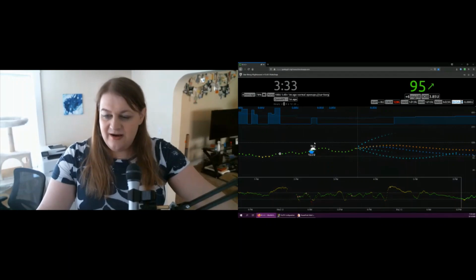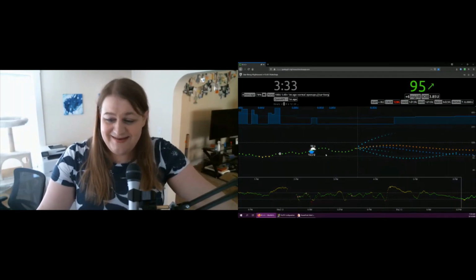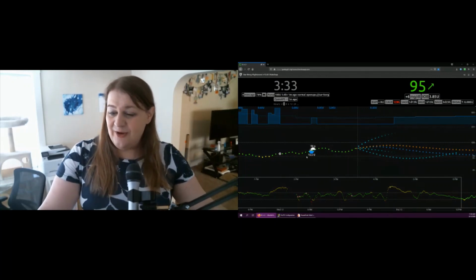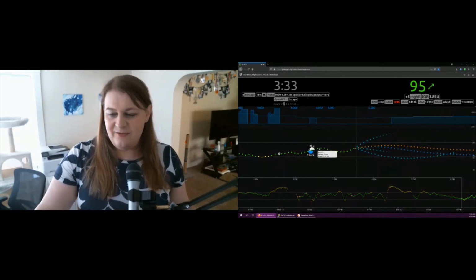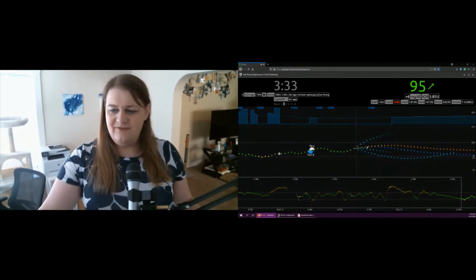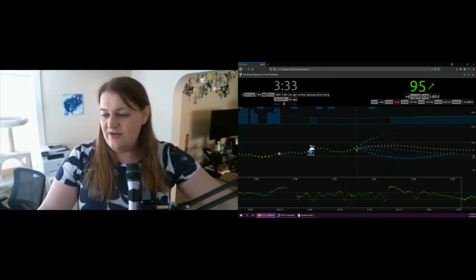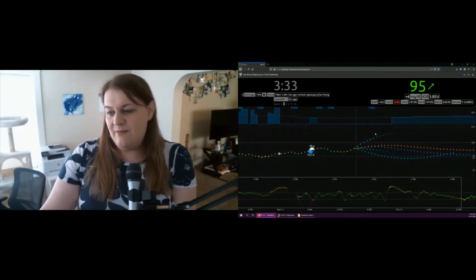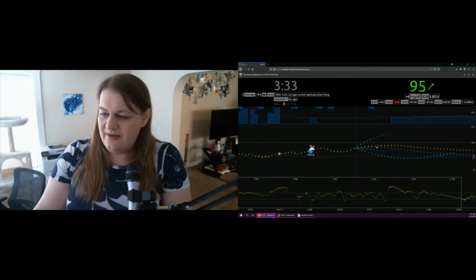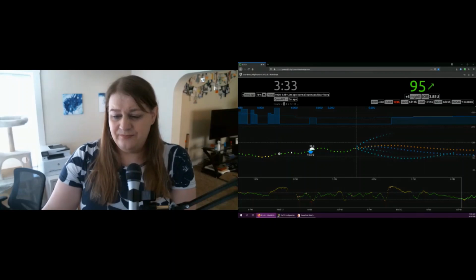So I can also look here for breakfast. I had 56 carbs of breakfast sandwiches. I took 10 units for it. So you can kind of see they're fairly close together. It rose a little bit, then the insulin kicked in, so it kind of fell back again. And these are the trends it's predicting. So the orange is kind of where it's expecting it to go. The other ones are some other variables. You can kind of see combined together, it produces the orange. So it's looking like I'm going to stay pretty in range given its calculations.